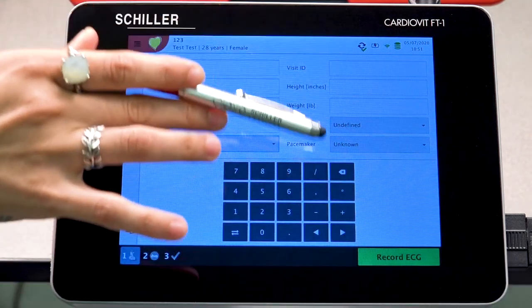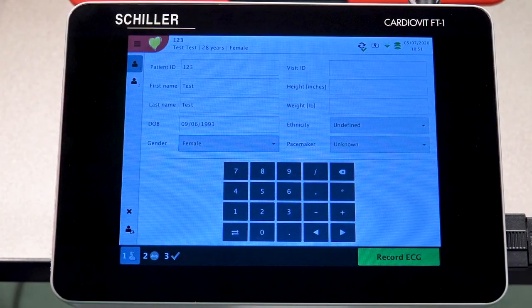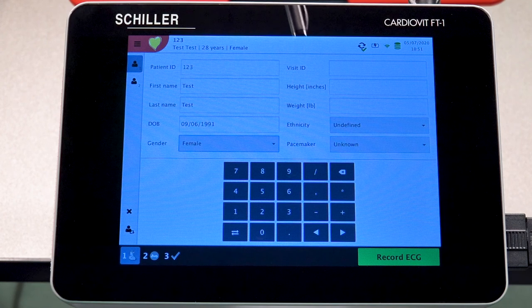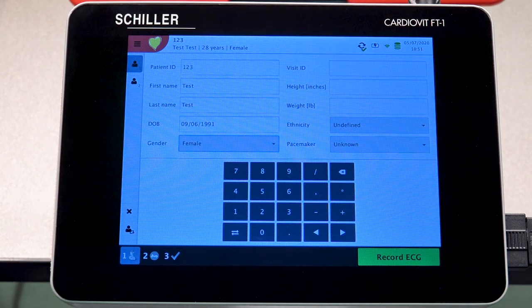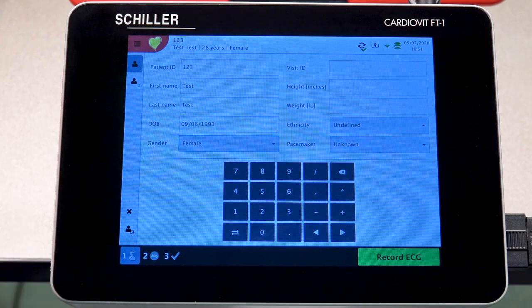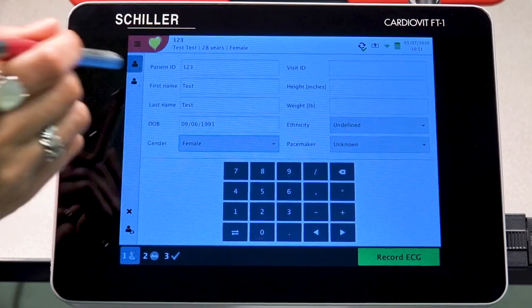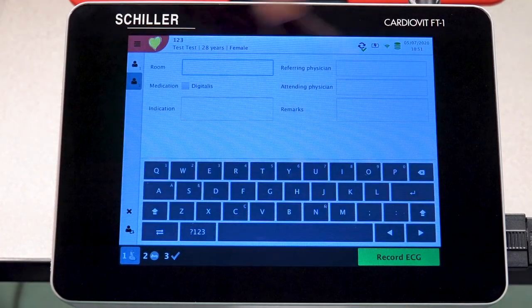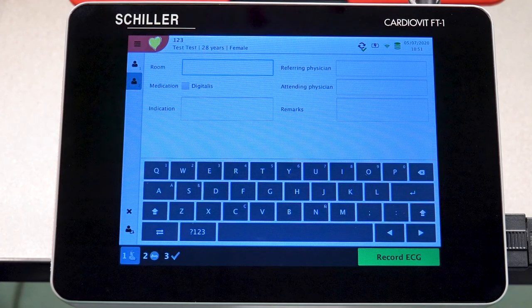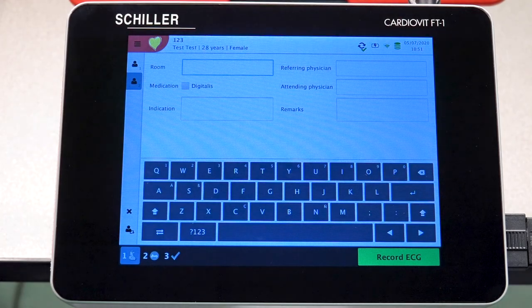On the right side, you can also see more fields to enter additional patient information, such as their height, weight, ethnicity, and whether or not they have a pacemaker. There is also a second field for additional patient information if you choose to fill it in.